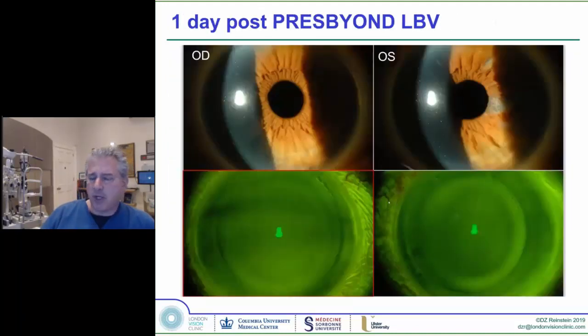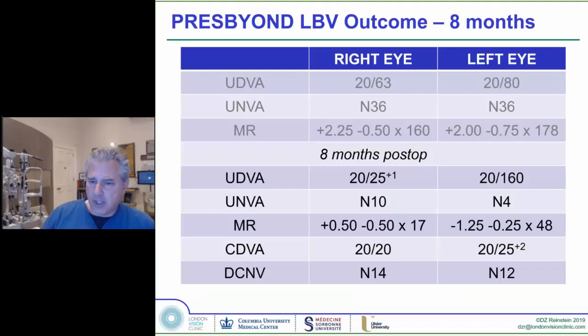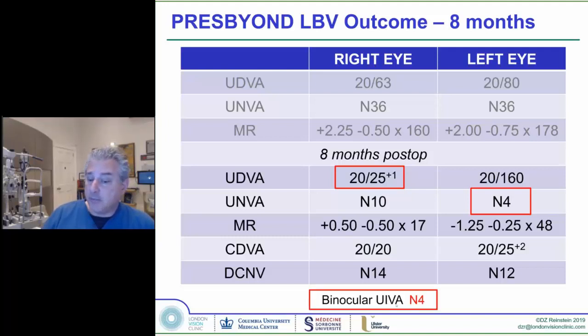And this was his post-op day 1 refractions. You could see that he was plano and about -1.375. And here we are. He was seeing 20/20 and N4, 20/25 actually, without correction. His intermediate vision, though, was N4 as well. Okay, and that's important for a pianist.